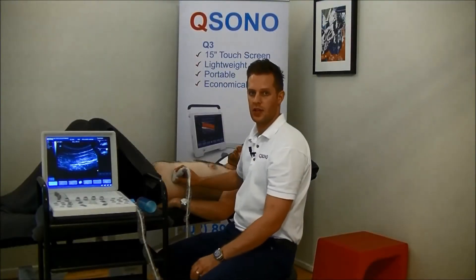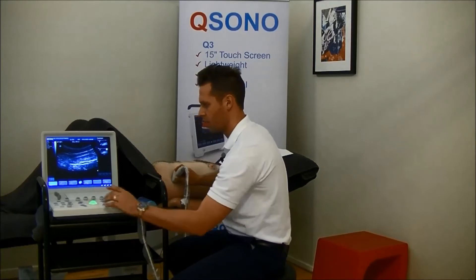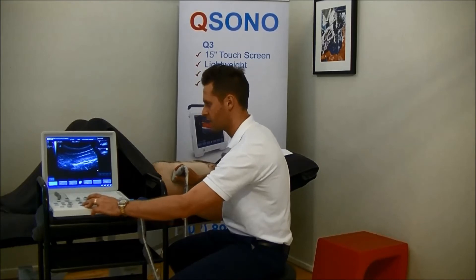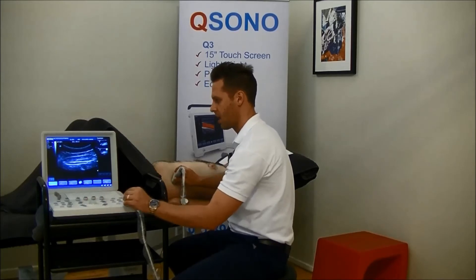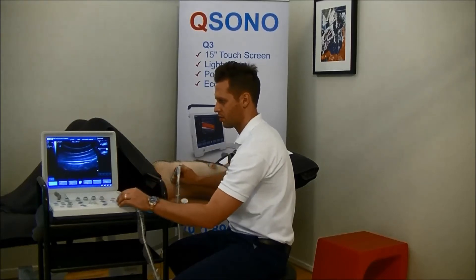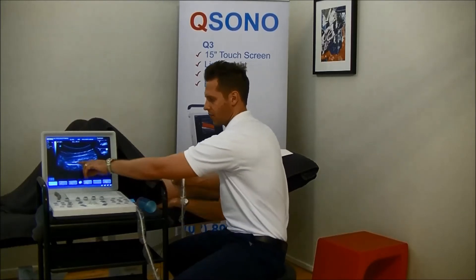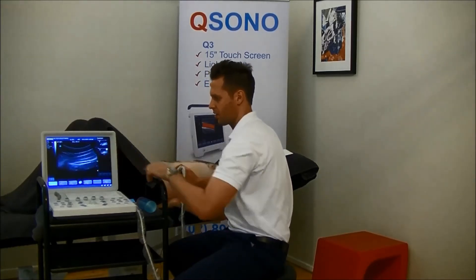The next thing we're going to do is adjust the frequency. If we change the frequency from general to a higher resolution, we should be able to get a clearer image. Here it is on the highest resolution for this setting. I'm also just going to turn down the brightness or the gain a little bit.